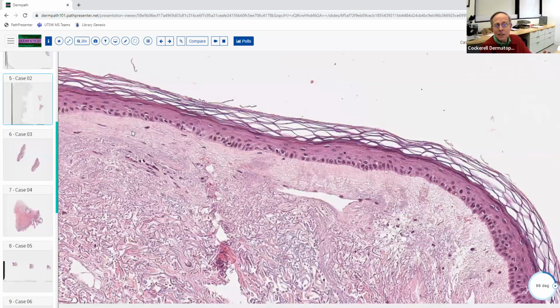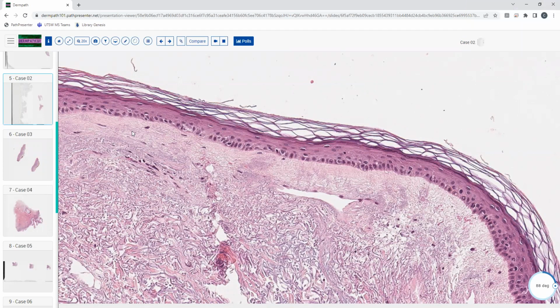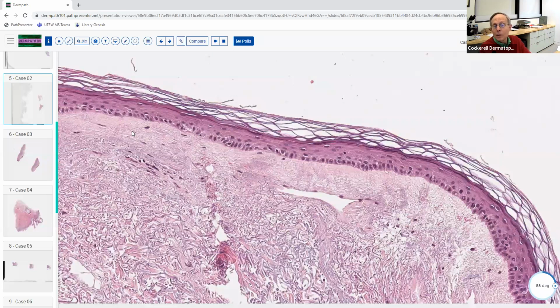So when you see hyalinized collagen, what does that sort of trigger to you when you see that? Is it like radiation fibrosis? Well, think about the pattern. Mhm. So if it's hyalinized, it basically means there's homogenization of the collagen bundles, and there's usually a decrease in the number of fibroblasts. And so if you look right in this area, there's almost no fibroblasts here. There's very few. So this is a sign of sclerosis, and sclerosis is seen in a relatively few number of conditions. So that's helpful. You mentioned radiation dermatitis. That's one of the diseases that can cause that.